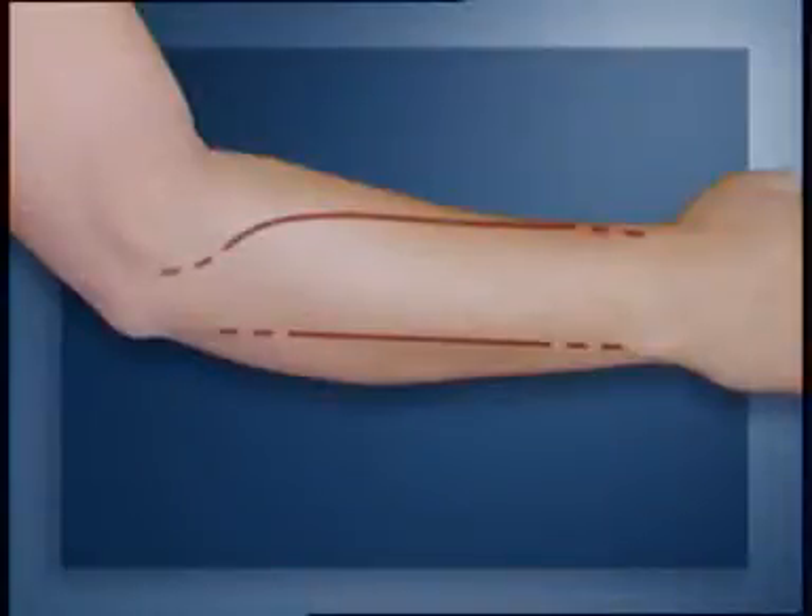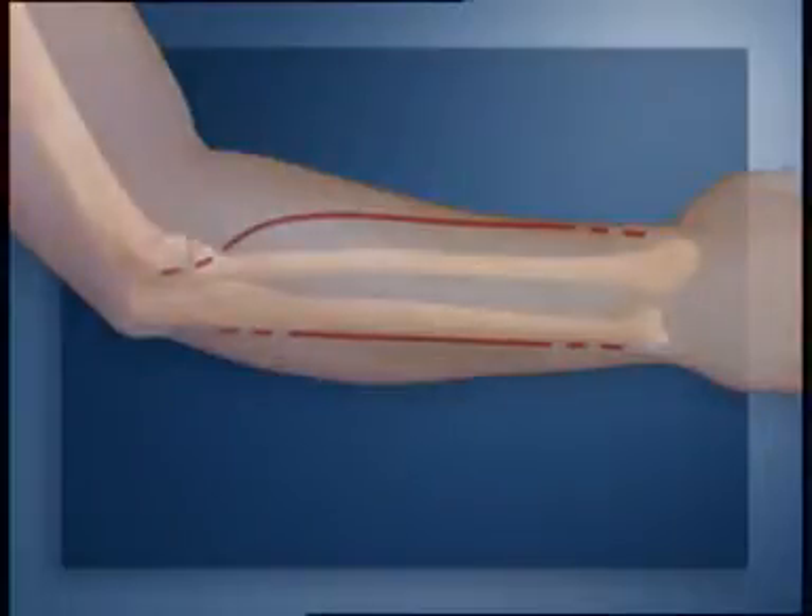To expose the two fractures, separate incisions — one for the ulna and one for the radius — are preferred. A single incision would need too much dissection.